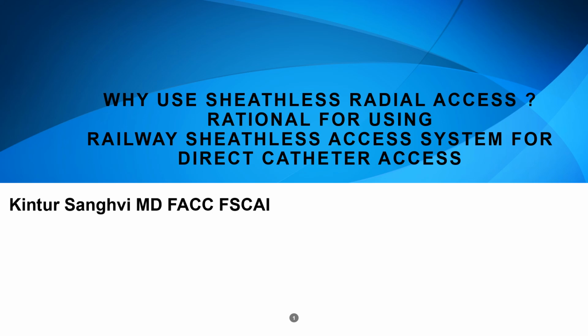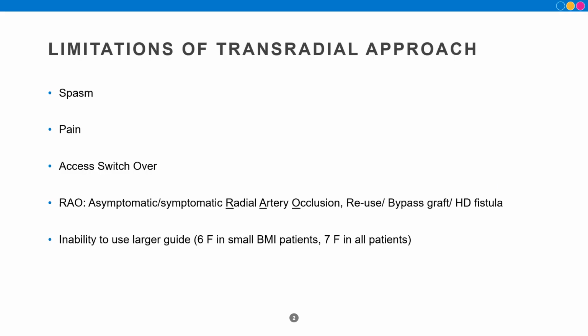Over the next 9 to 10 minutes, I'm going to explain why use sheathless radial access. The rationale for using the RailWay sheathless access system for direct guide catheter access. Even in 2019, the limitations of the transradial approach essentially remain the same.